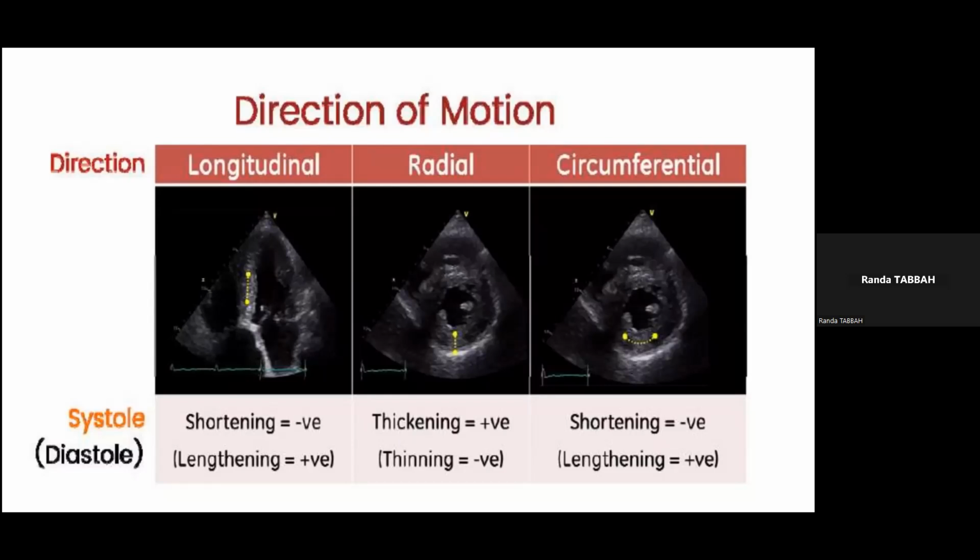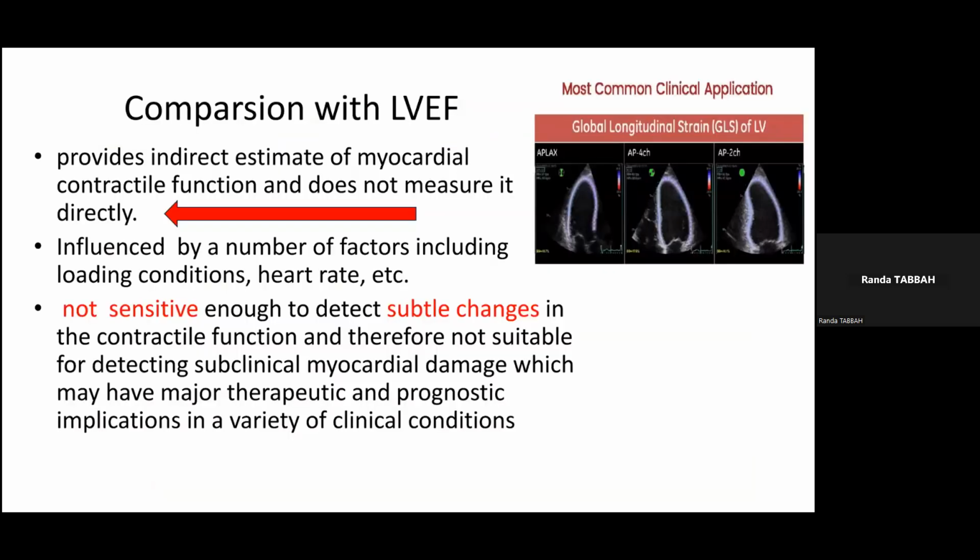And the studies used in several cases are mostly on the longitudinal strain. So it helps us to provide an indirect estimation of the myocardial contraction function, but it does not measure it directly.